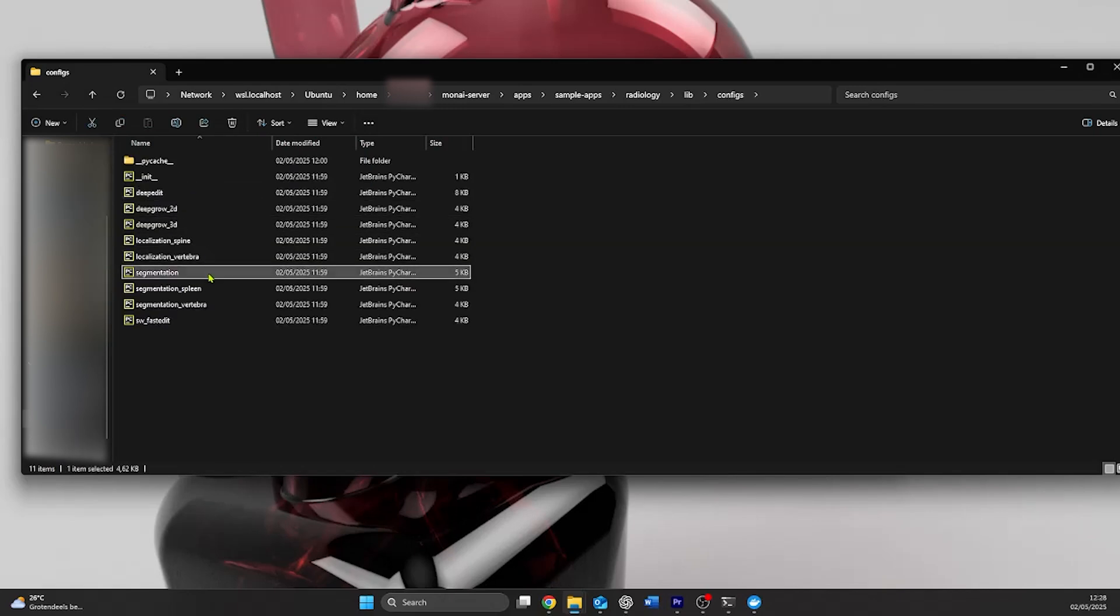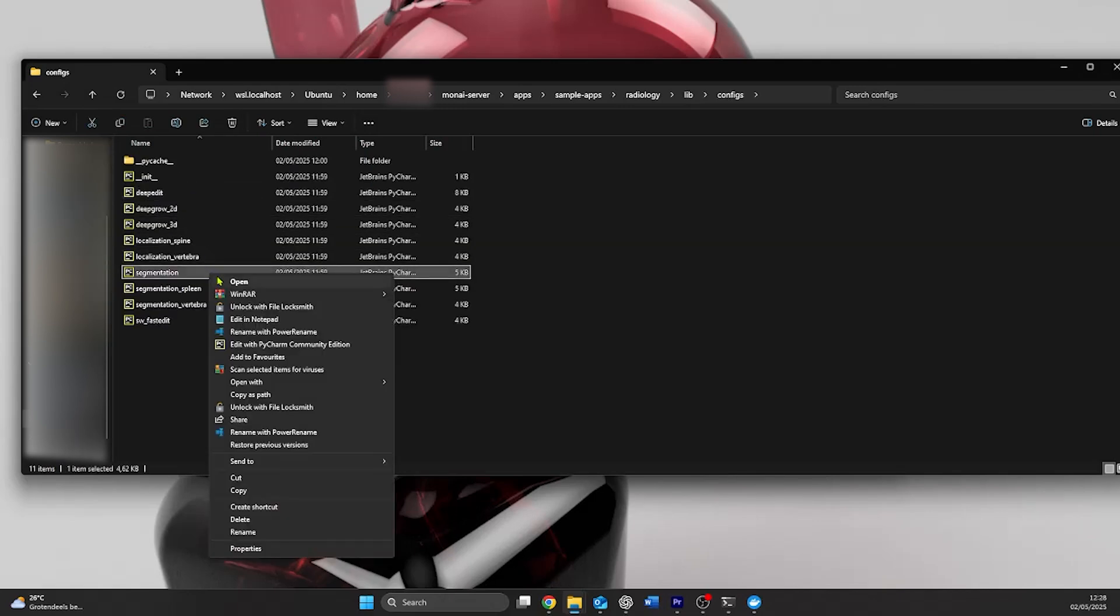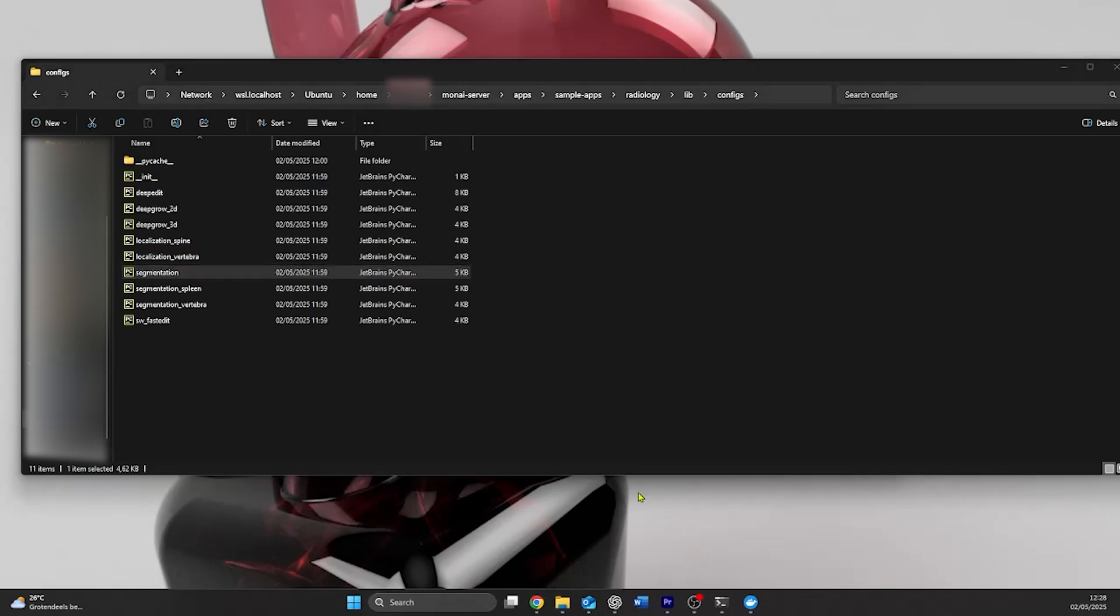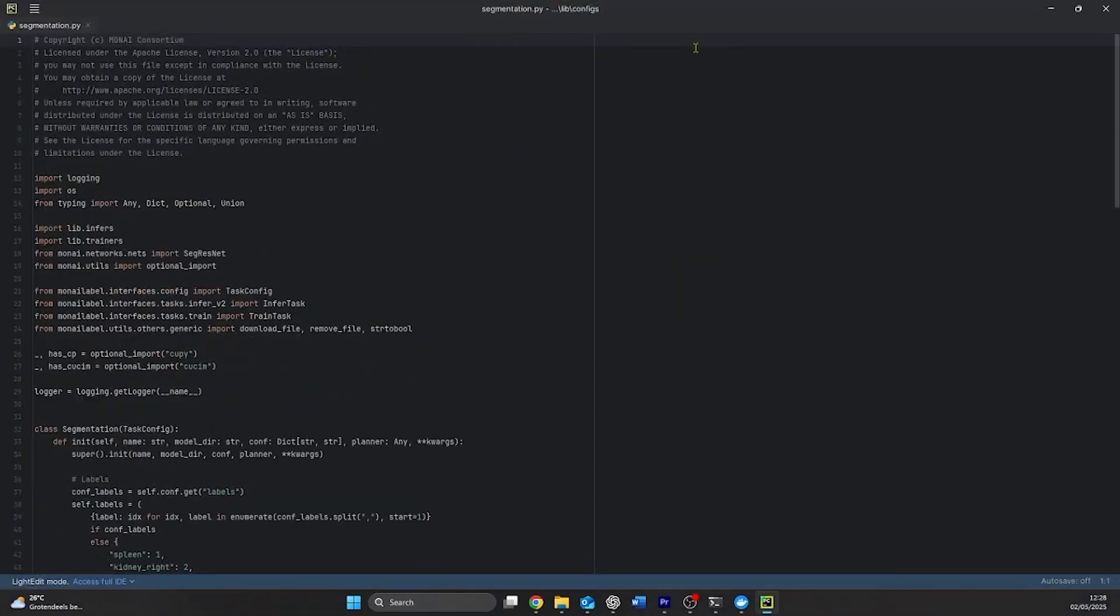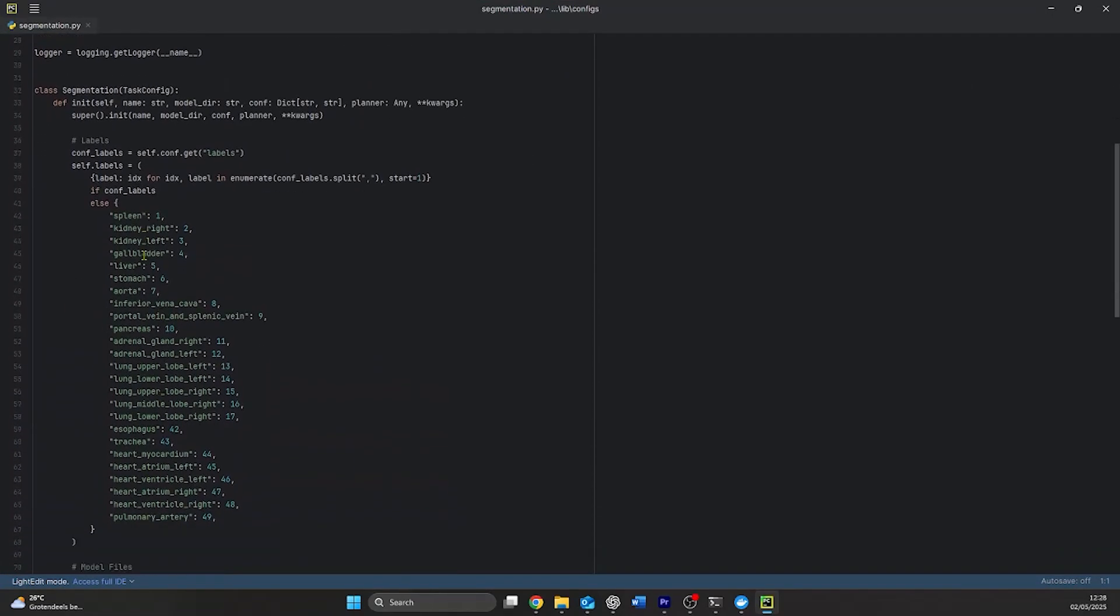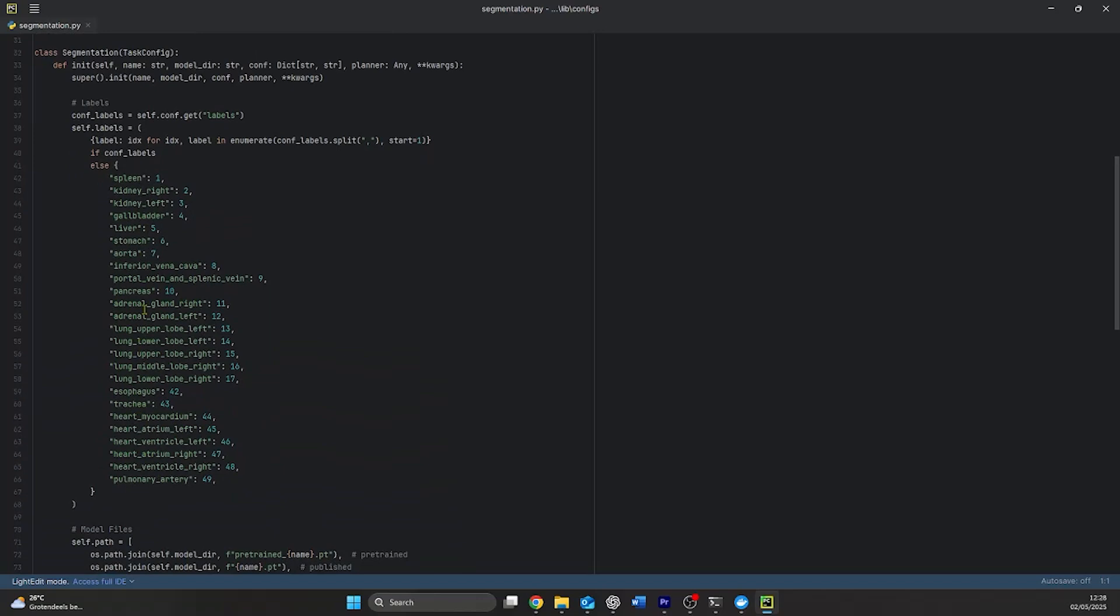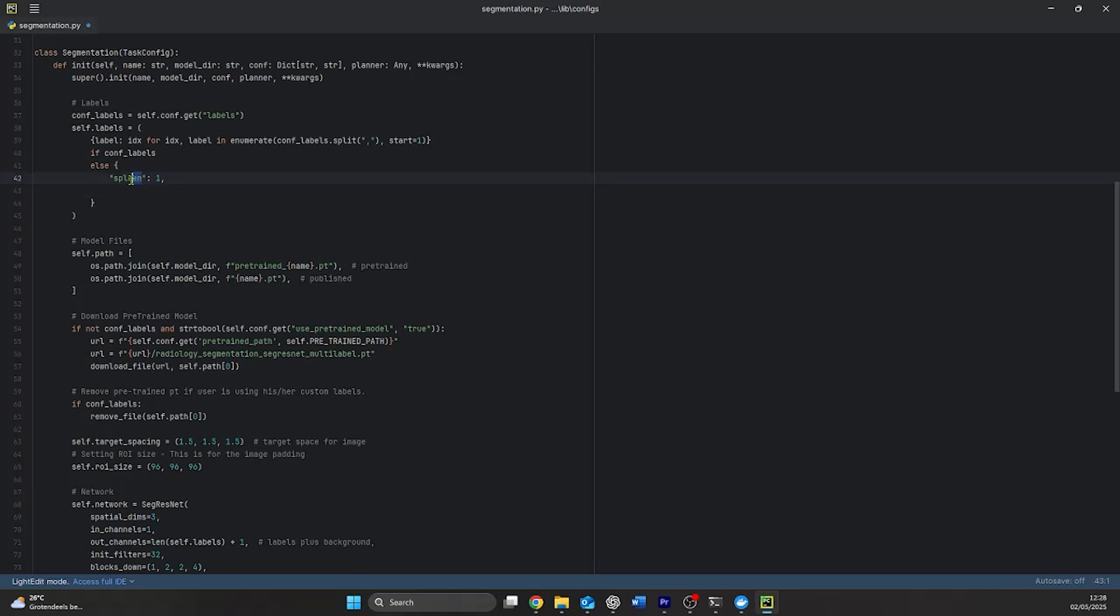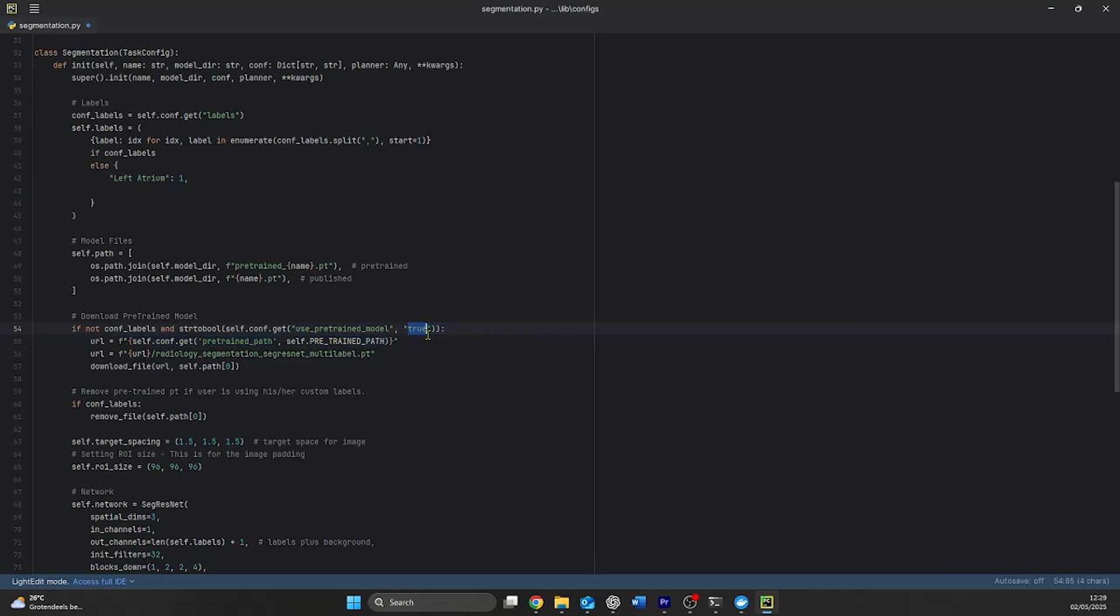After we have set our working directory, we'll need to configure our model the way we want to use it. So, we go to the config folder in the radiology library, we go to the segmentation model, which is the model that I will be using since it's easiest to use. And in that segmentation model that we open in any type of IDE editor, in my case PyCharm, in the configuration file for the segmentation app, we can see that it's currently looking for a lot of different segmentations. In this example, we are only looking to do the left atrium. So we delete everything we don't use, and we change the name of the first to left atrium. Furthermore, we set the use pre-trained model to false.